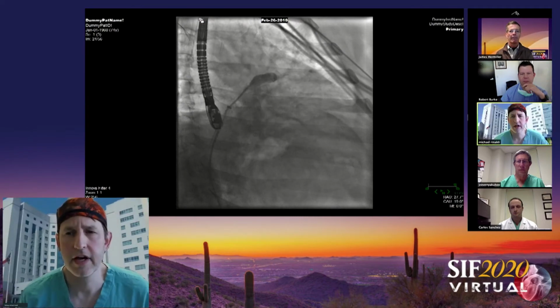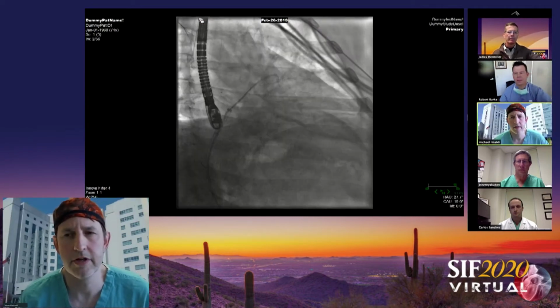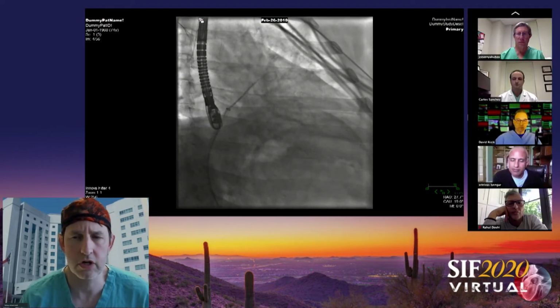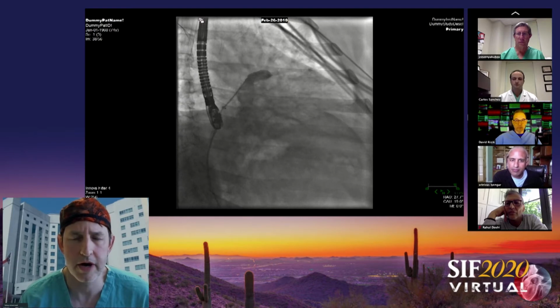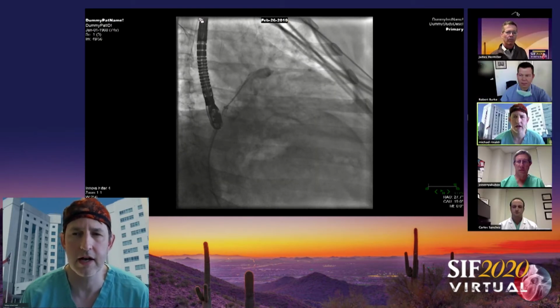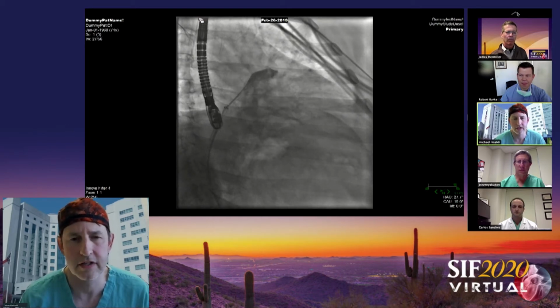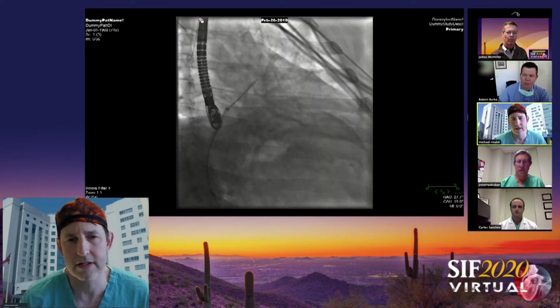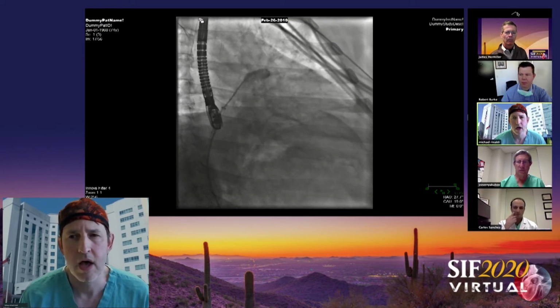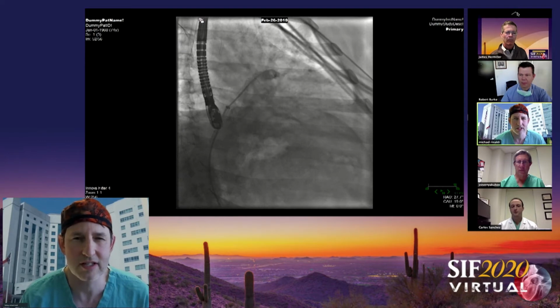I think imaging is going to be very institutionally dependent. If you have a strong CT, then that might be the way to go. If you don't have strong CT and you have strong TE, that's the way to go. In our institution, we have really strong structural TE, and we have superpower CT through Marcus Shear. We did a comparison, and it matched up to D.D. Wang's analysis: CT makes it about 2 millimeters bigger on average than TE, and the depth is pretty similar.